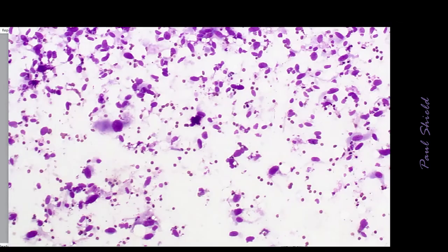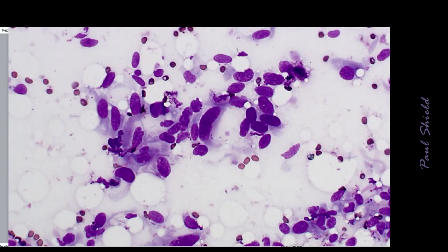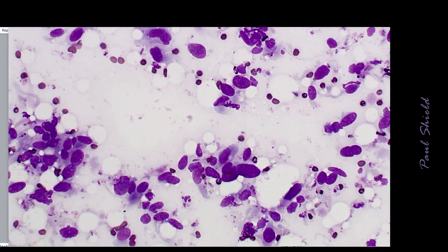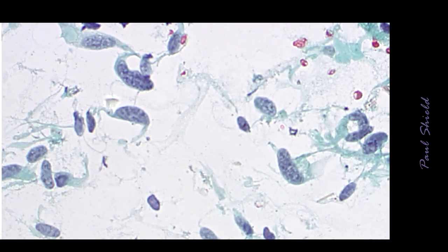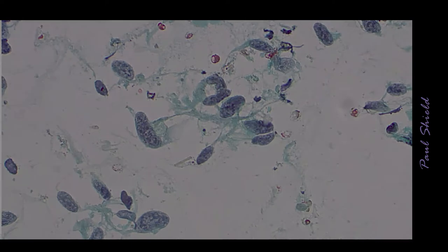That can vary up to this sort of pattern, which is really what I would call a spindle cell pattern. And by that I mean cells that have a cigar-shaped nucleus and a bipolar, strung-out cytoplasm. So nearly all the cells here are quite elongate. Some of them are really quite cigar-shaped. This is the pap on the same specimen. And you can see the nucleus goes right out to the edges of the cytoplasm in these true spindle cells.